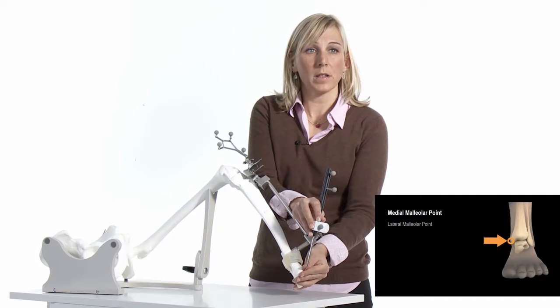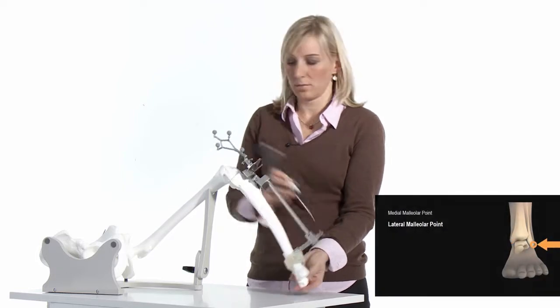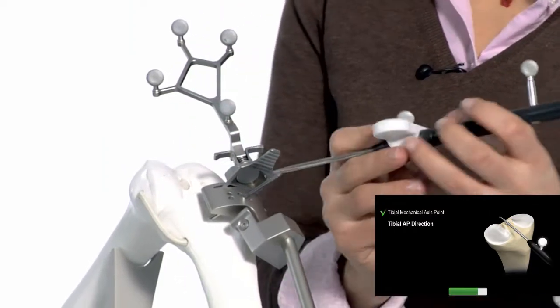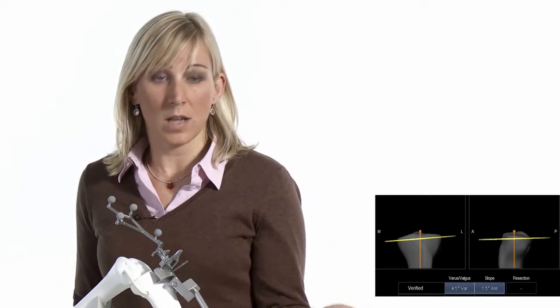First, acquire the two malleolar points, then the mechanical axis point, and finally the AP direction. Now the registration is done and the software displays the alignment information — you will see the varus/valgus position and the slope.